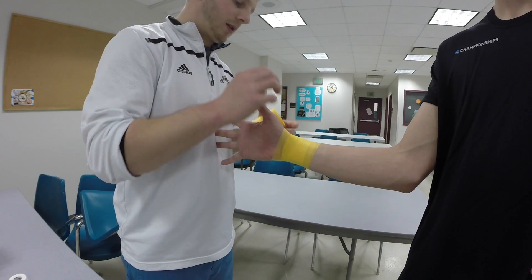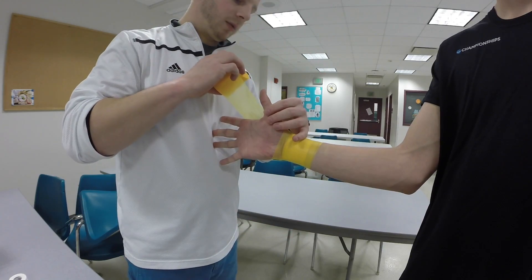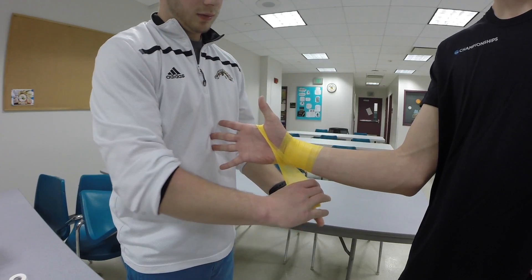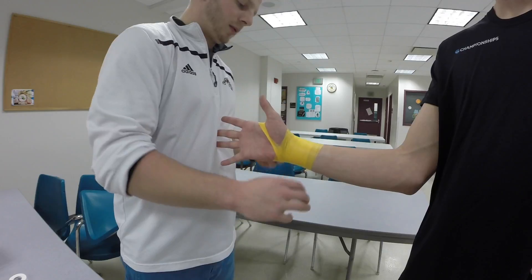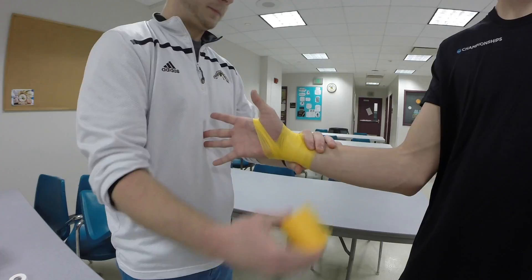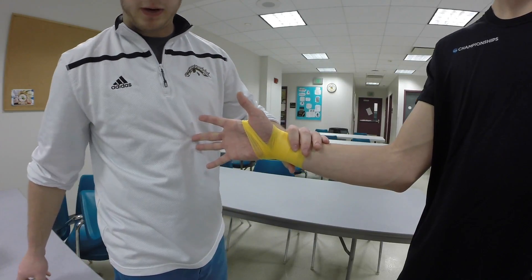As I come through the thumb to prevent irritation, we're going to flip the roll and continue the pre-wrap.